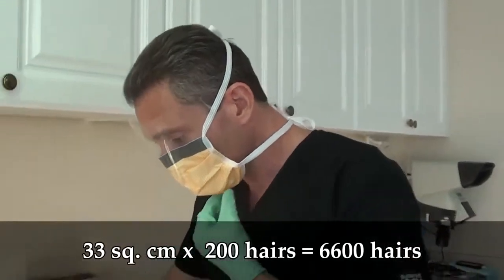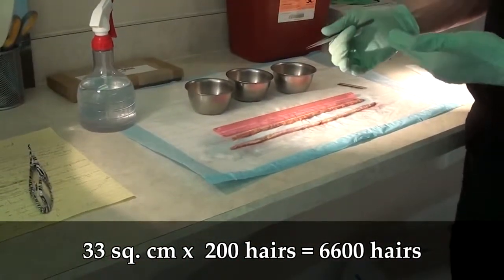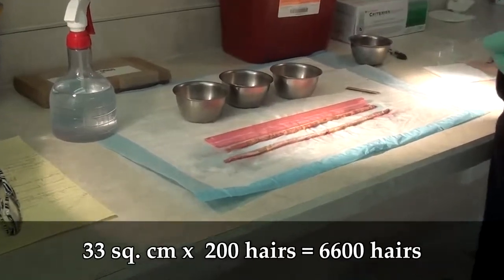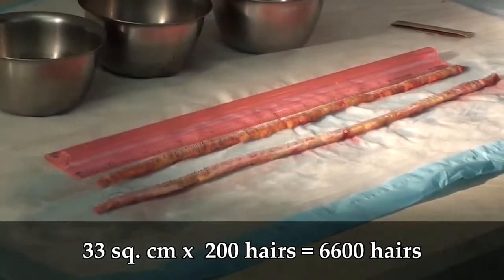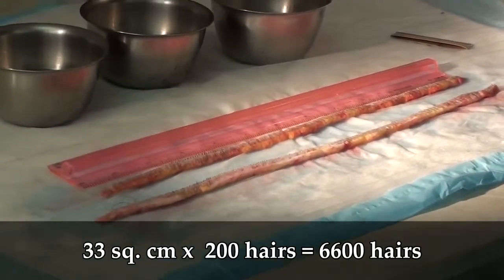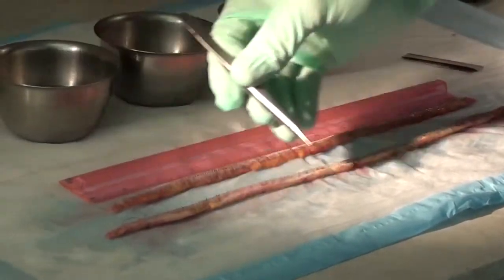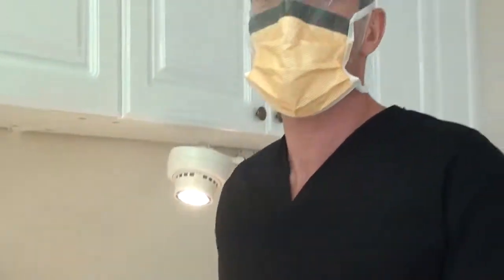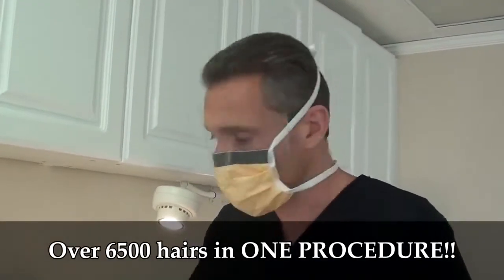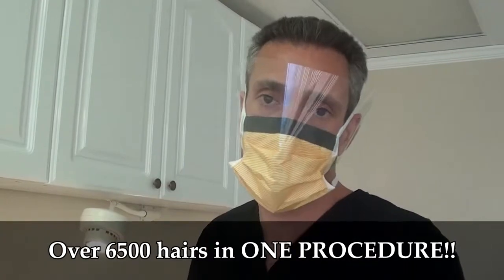So if I have 33 square centimeters of tissue, let's just show how the numbers work. Let's say we got 200 hairs per 1 square centimeter. We have 33 square centimeters. That means we're going to yield about 6,600 hairs. And as we talked about, some hairs did get transected, although it's very little. So we're going to yield well over 6,500 hairs just from what we got here. And that's on the low end because his density was higher than the 200 hairs per square centimeter.